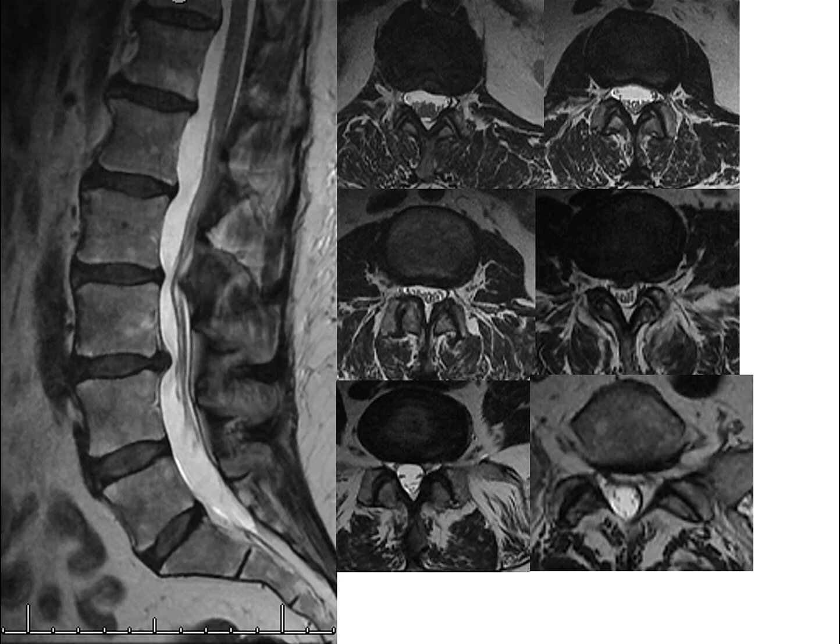I guess one other question I have is, does it matter if it fuses or not? When you have those 3 dowel rods across there, that's 3 separate points of fixation, and that gets rid of the motion. Some people call it a fibrous fusion. It holds you in a static sense, but if it's not fused and you have micromotion at the joint over years, I don't see that they're doing anything yet. I think the joint motion will return. The amount of stress we place across those things is huge, even though the amount of mobility is small.